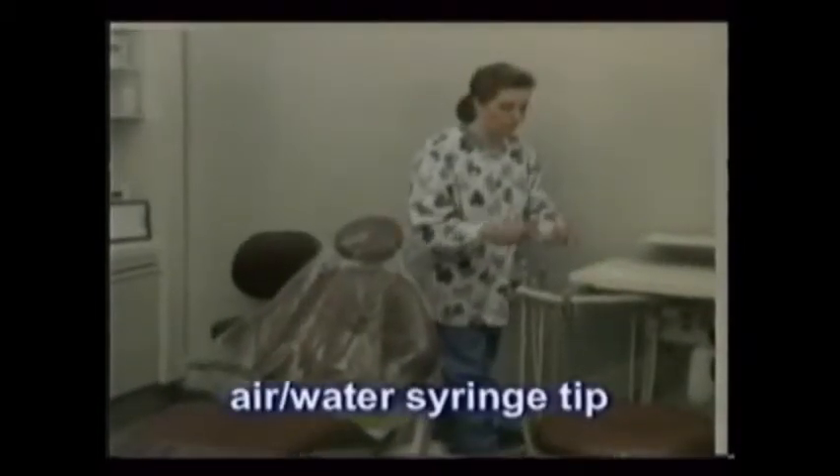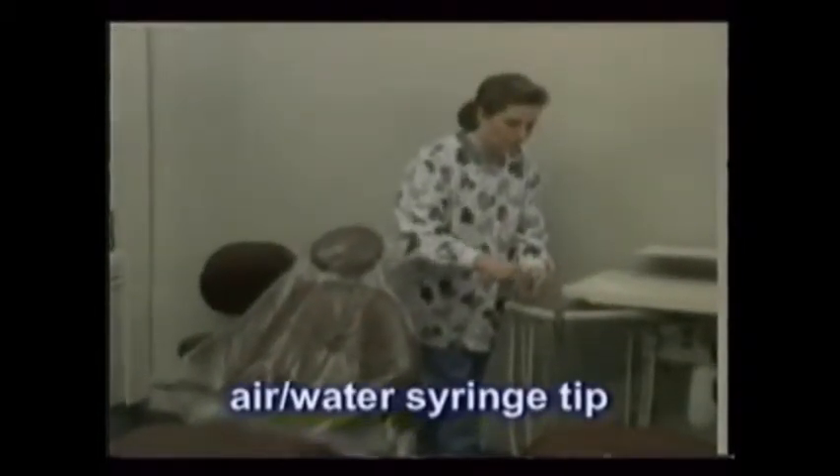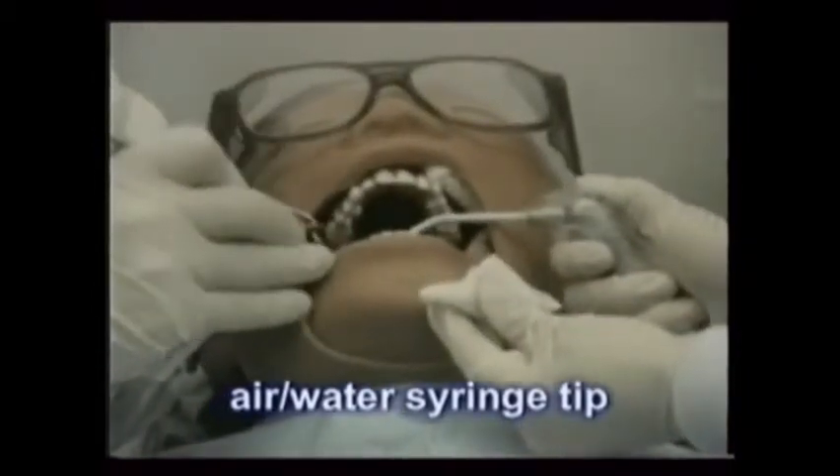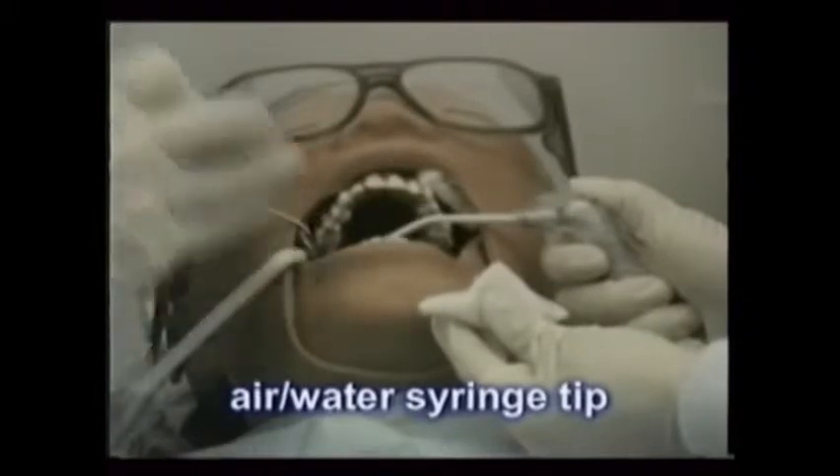The air water syringe tip provides water for washing, air for drying, or a blast of both combined for maximal cleansing of a cavity preparation during and after the removal of decay.